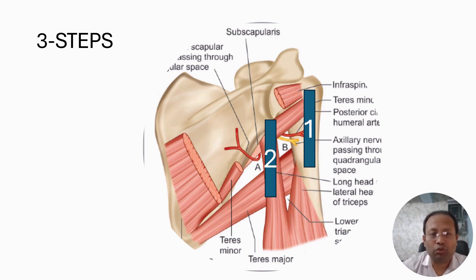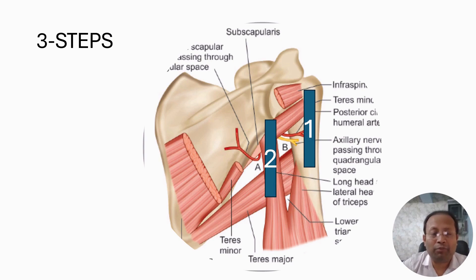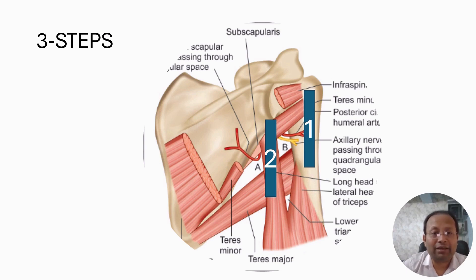In Step 2, the ultrasound probe will be moved and placed in a long axis view of the long head of triceps. We will then be able to find the short axis view of teres minor and teres major.